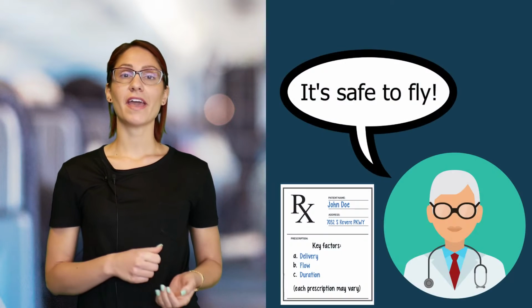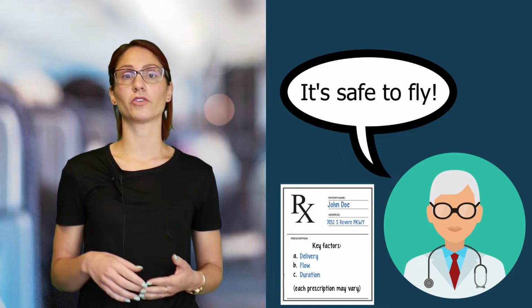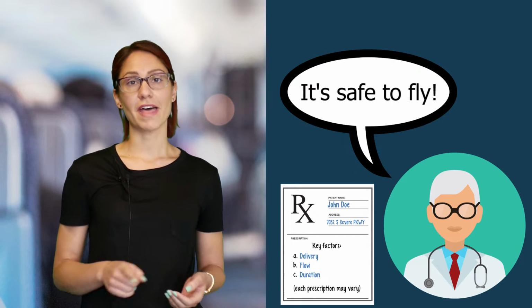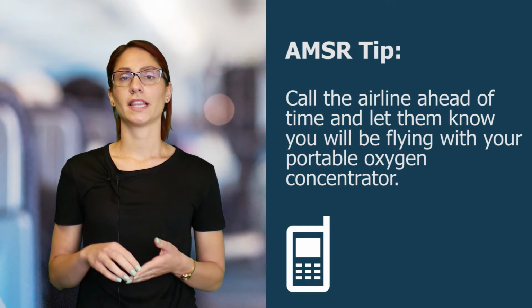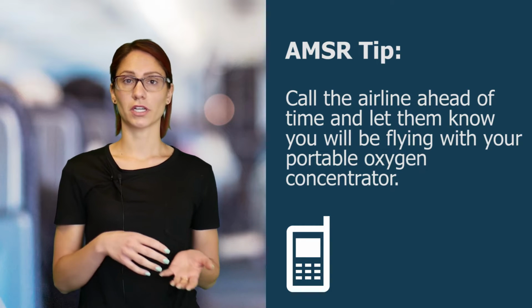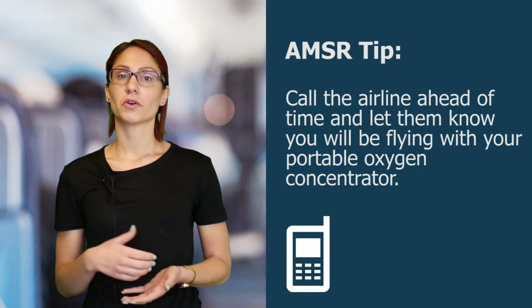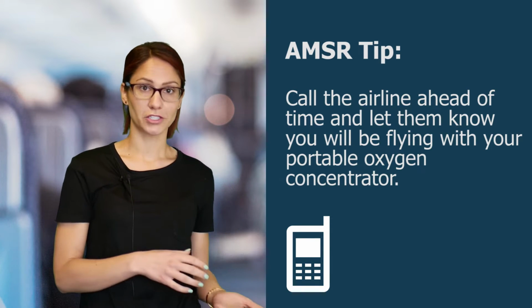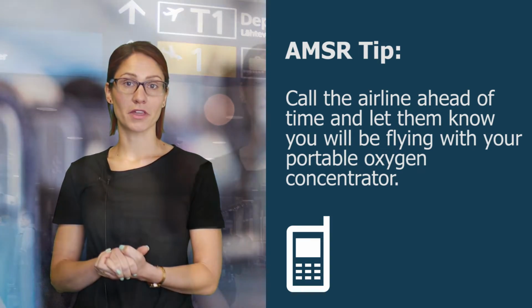All right, so if you are traveling by plane, there's a few things that you need to know when you travel with your oxygen concentrator. The first is that the FAA requires a letter from your physician or doctor's office saying that you do need medical grade oxygen. So you want to make sure you have that with you when you get to the airport. The second thing is to call the airline and let them know that you're going to be traveling with a portable oxygen concentrator. Most airlines let you use the one that you have, but some do require you to use the one that they have on board. So if that's the case, you want to get all the details ironed out so your traveling day is nice and smooth.